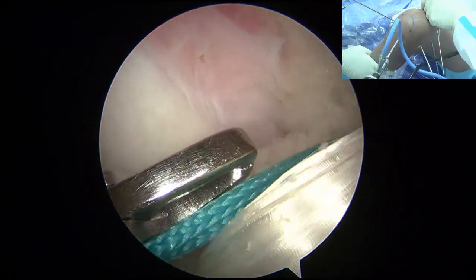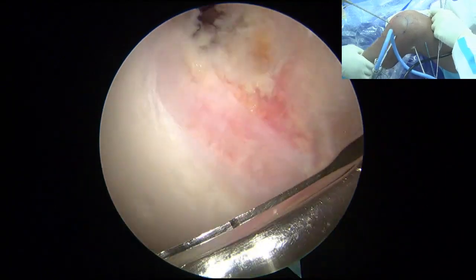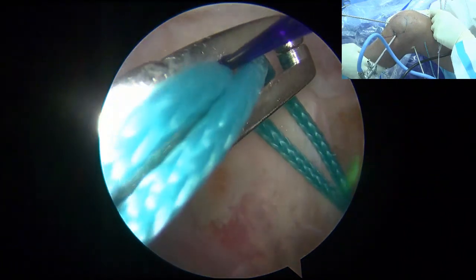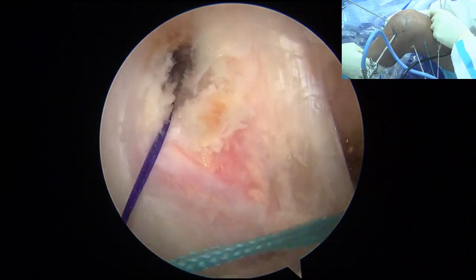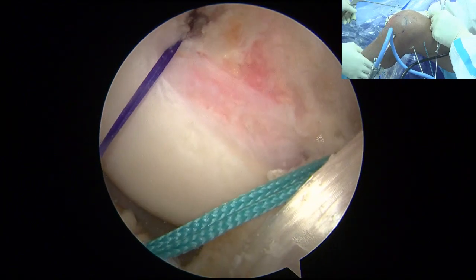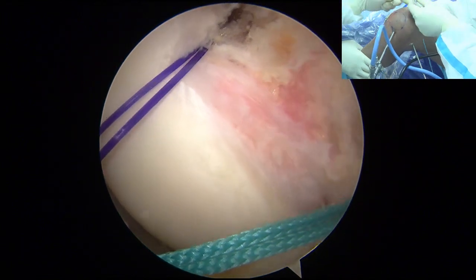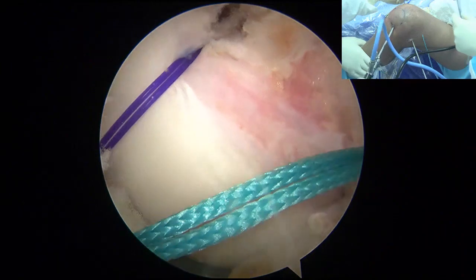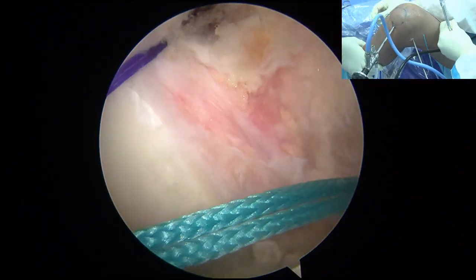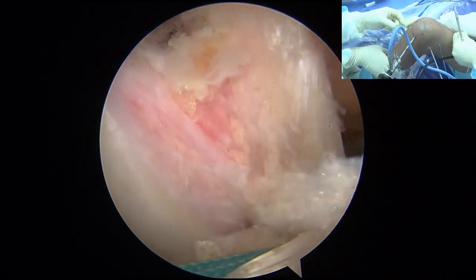Okay, hold here. What is green? 绿色, purple 紫色. Take it out at the same time. 紫色绿色呢一起抓. Now this is for the femur. We lock it for the femur, here on the condyle, like that. But now it's in the same hole, right? 穿出到同一个. Same like you have the cannula.